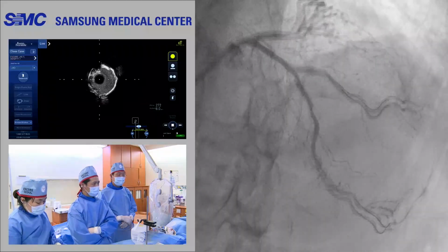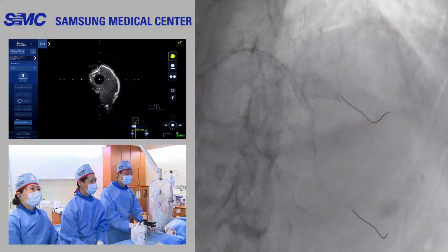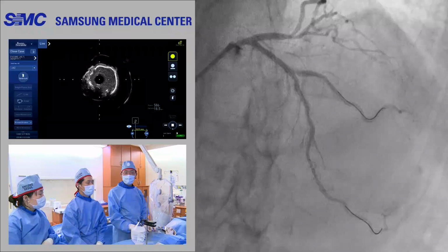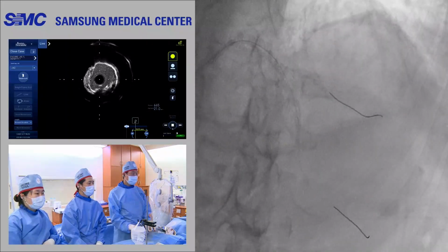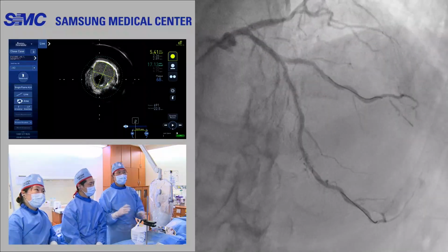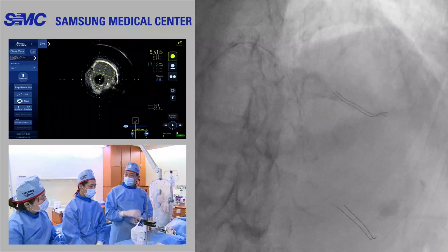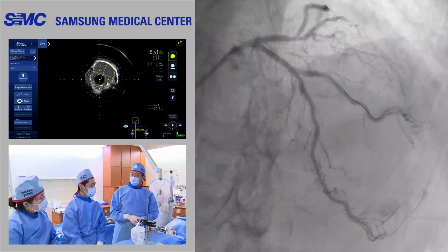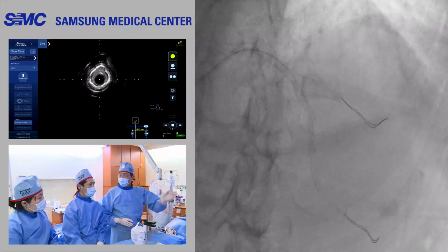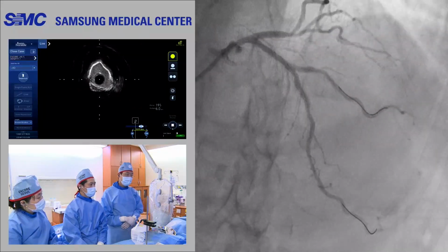Maybe I can try, but I can't promise. 3 months? How about 1 month? Considering 1 month increases thrombotic events compared with 3 months, without any reduction of bleeding episodes. In the pre-stent era, we experienced acute thrombosis, around 2 to 3%, if we had a type B or type C dissection. This is not type B, so the risk is low, I think.